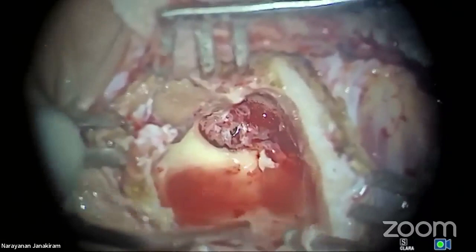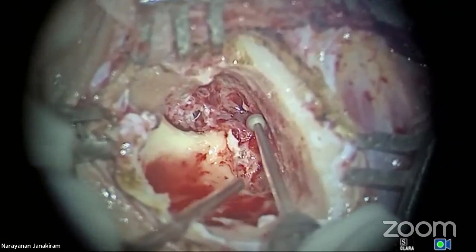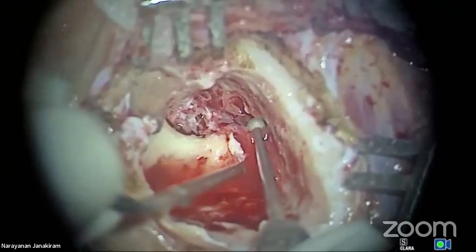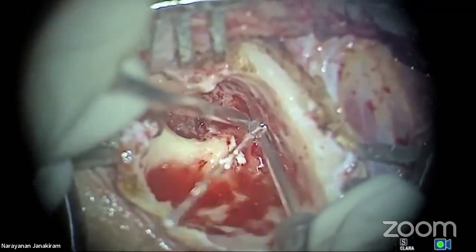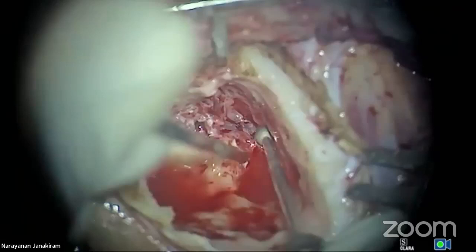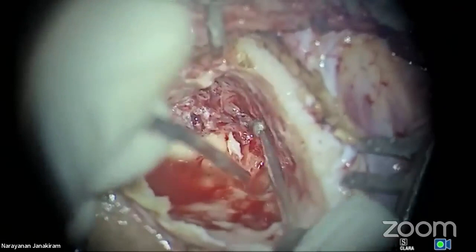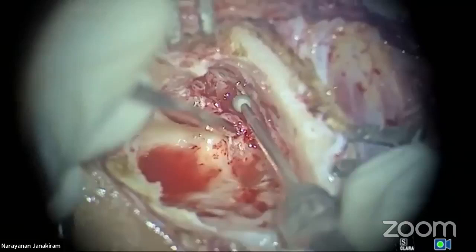Now, I'm now going here. This is a dangerous area because you have to expose this cholesteatoma. And you are very close to the semicircular canals. See that. Can you see that, all of you? I'm hugging the dural plate. Okay, now I've gone to the edge of that cholesteatoma. I am more towards the dural plate because I can use the dural plate better rather than to use the area of the semicircular canal. You understand my point?